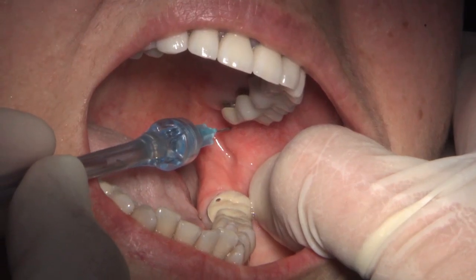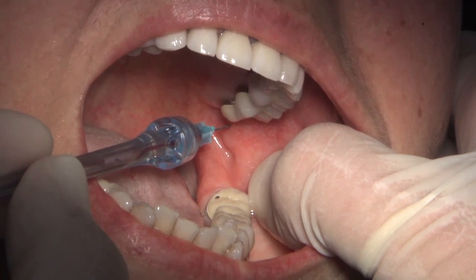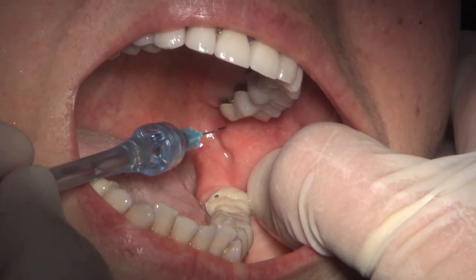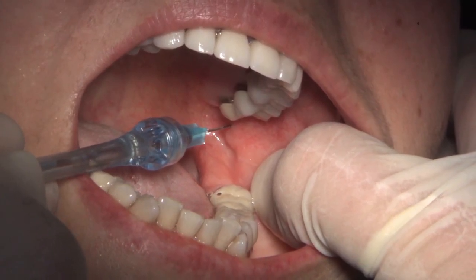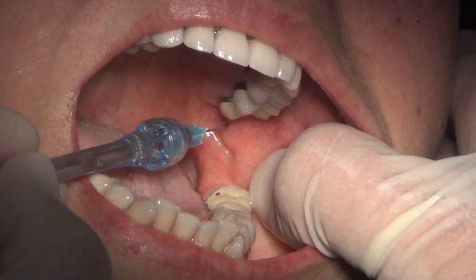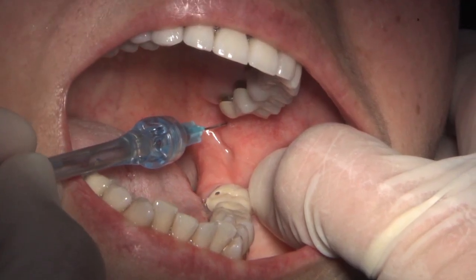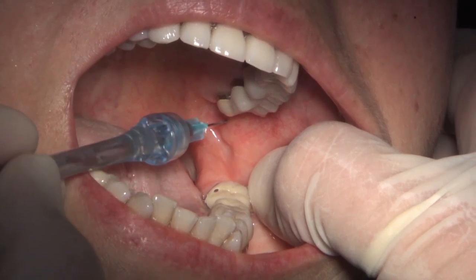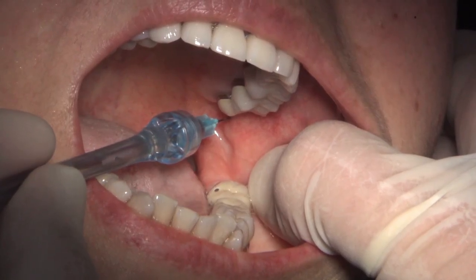Aspirate at this point — correct. From here, things that are similar. That's positive there. So you want me to come back out? Let's do. How far — right about here, maybe? Do you feel you can clear that? What direction would you like me to clear it in? Just go ahead and do a second aspiration and see if we've got anything. Okay, that looks clear. Go ahead and go back to site. With anesthetic? Yeah, go ahead and twizzle, advance again, and then aspirate again at your site. If we're clear on that one, we'll continue. Yeah, we are — that looks good.